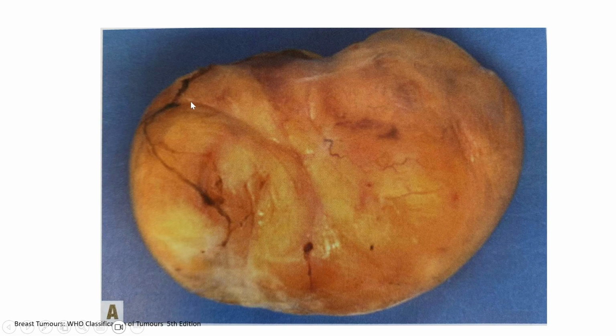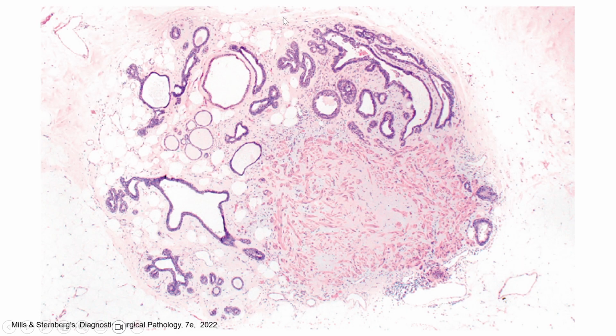So this is a gross image. We can see this well demarcated, kind of encapsulated. If you do not know this is a mass, you would just think this is normal fat. And then this is a well circumscribed mass, a nodule, and you can see different kinds of components: normal glands, normal ducts maybe a little bit dilated, and then we have fat, we have stroma, we even have some smooth muscle here, but the whole thing is just disorganized. They're just everywhere, and then they form a mass. So that is the hamartoma.